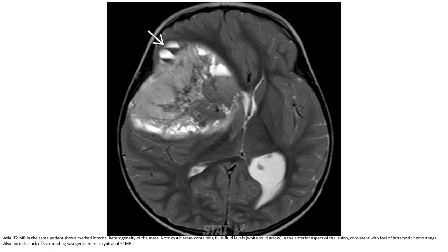T2 MRI in the same patient shows heterogeneous signal of the mass, with cystic areas containing fluid. There is signal in the anterior aspect of the lesion consistent with focal intracystic hemorrhage. Also note the lack of surrounding vasogenic edema, typical of ETMR.